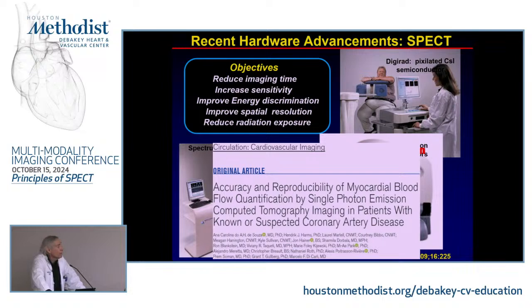And those higher counts have more recently been used for looking at, as we do in PET imaging, myocardial blood flow measurements.